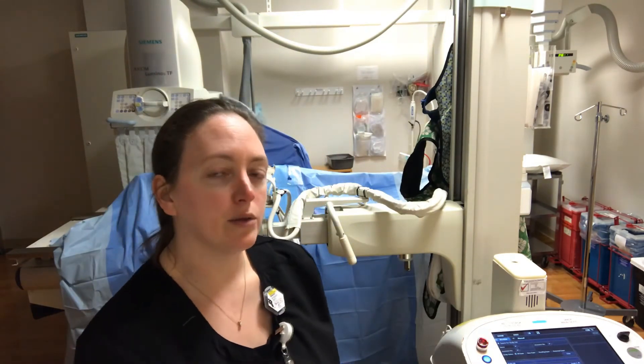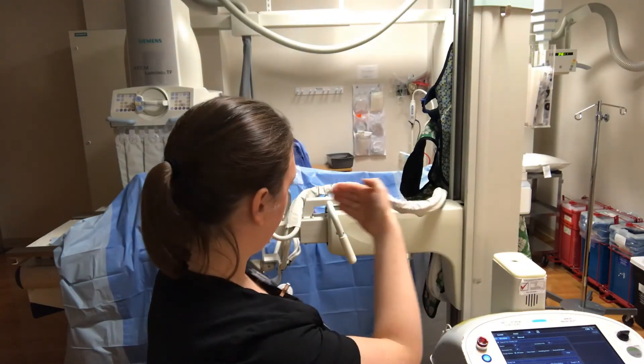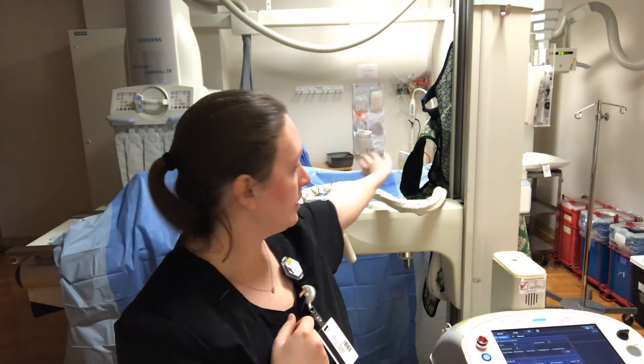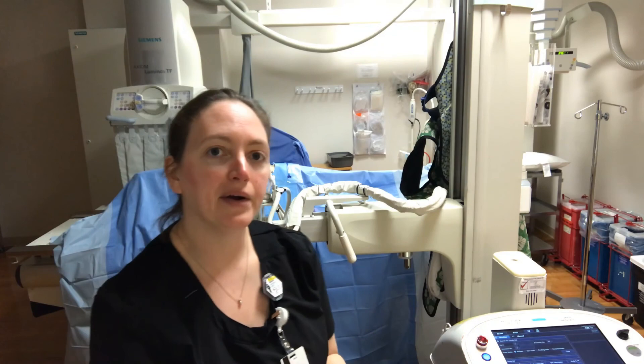Just be aware of where you are in the room. Anytime you're circling around a sterile field, you want to face that sterile field — never put your back to it because you're more likely to cause contamination. When circling around to get your cassette, face the table and wear gloves, because the surgical tech put that sterile drape on there — don't take it off without gloves. Circle back around after the exposure, take your grid cassette away, circle back, put the machine back in park, and drive off.